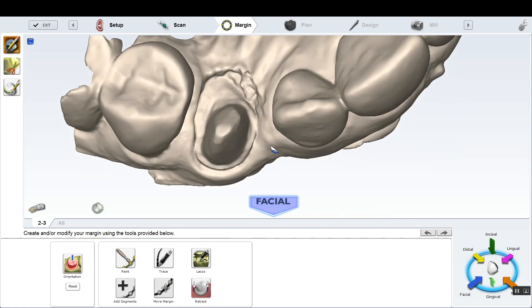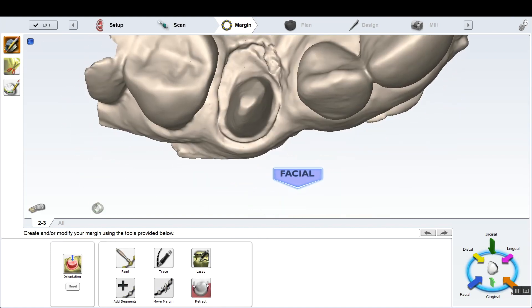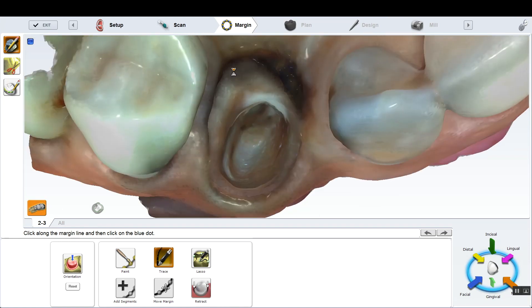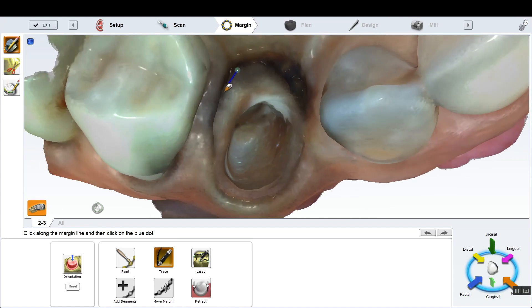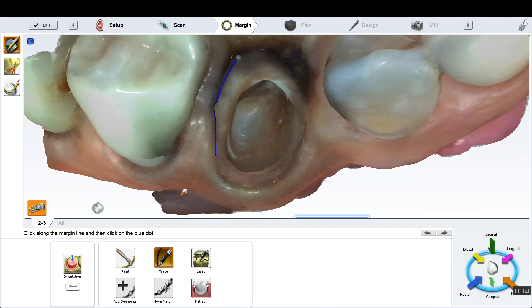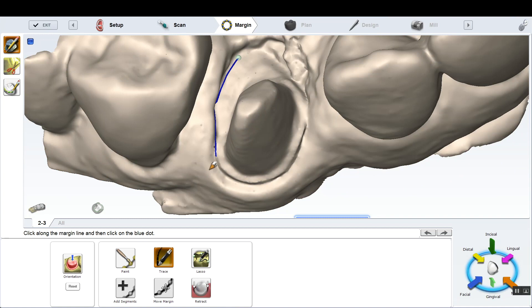So orientation, setting the path of insertion, kind of looking straight down at that tooth. And now we're going to attempt to try to mark our margin. We kind of barbecued tissue a little bit, trying to get it out of the way.